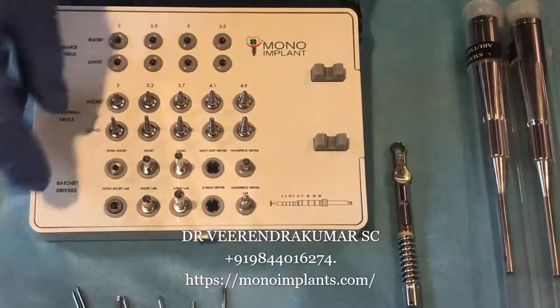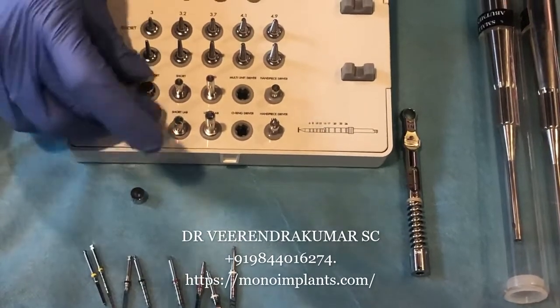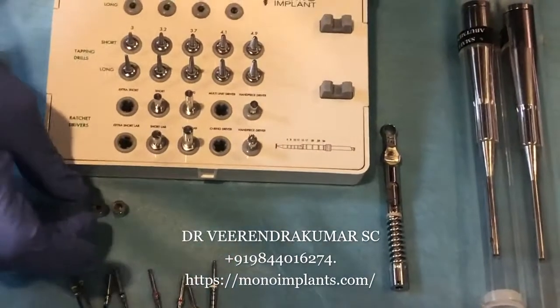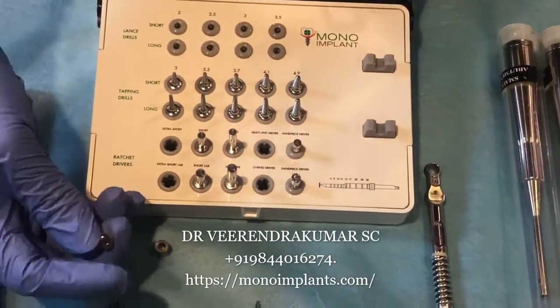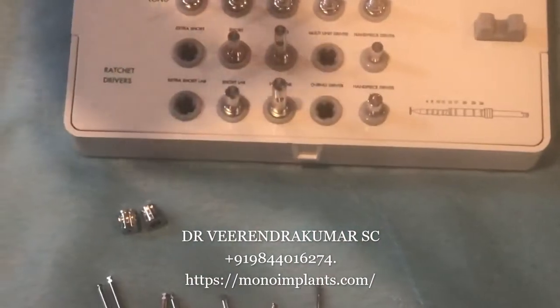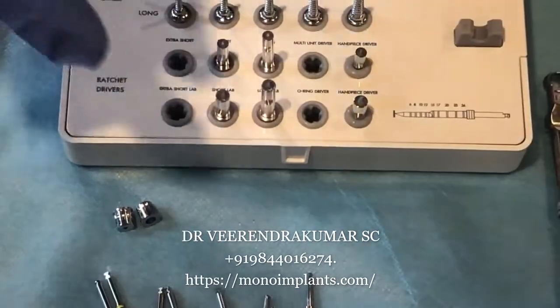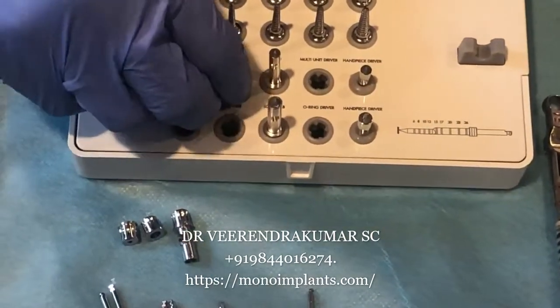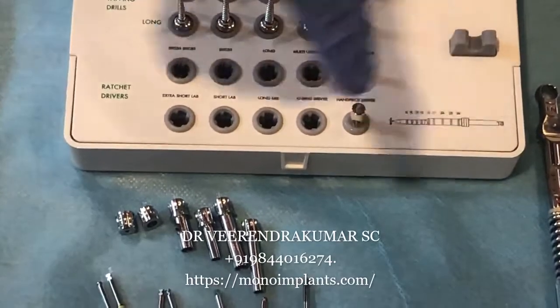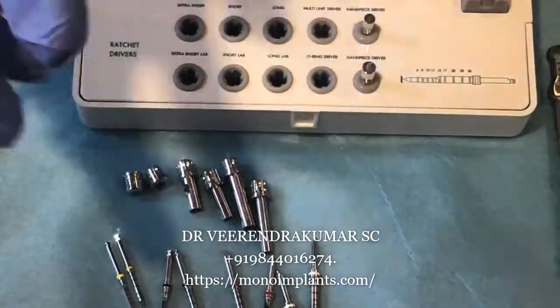Coming to the ratchet drivers — this kit contains very small ratchet drivers. There are two types: one for a small hex and one for a larger hex, because we have two types of abutments. Look at the size of these drivers — they are particularly useful in the posterior-most areas when mouth opening is difficult or when you are not able to drive the implant even with the ratchet. We also have the more commonly used medium size, and then a longer one — sometimes the lip comes in the way when inserting the implant, so long drivers help avoid lip injury.